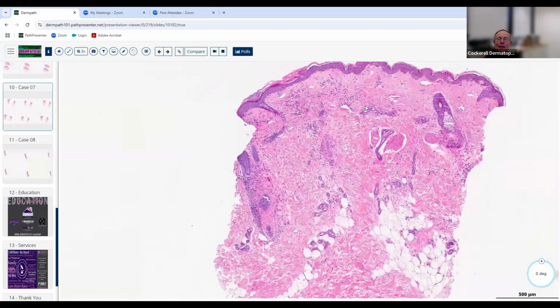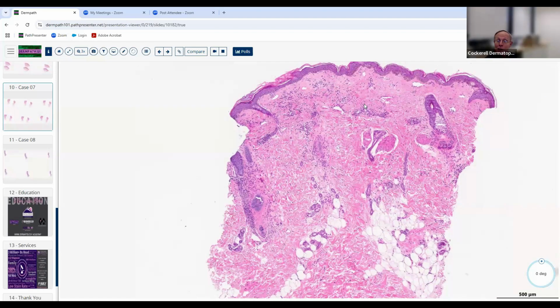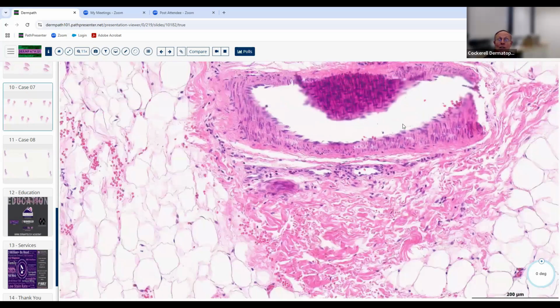So let's go back and start thinking of diseases that give you an interstitial mostly process. Things like urticaria, things like interstitial GA, things like KS, things like metastatic breast carcinoma, things like cellulitis, and then an infiltrate of lymphocytes, plasma cells, EOs, with thickening of the subcutaneous fat septa here, and maybe incipient sclerosis.